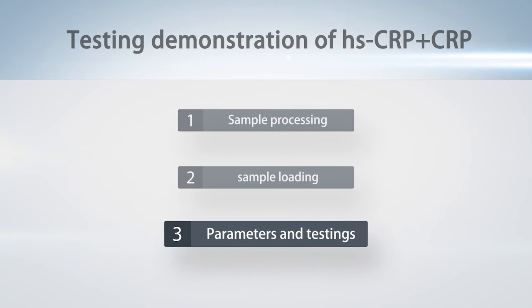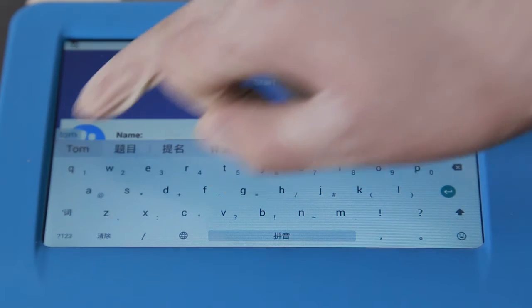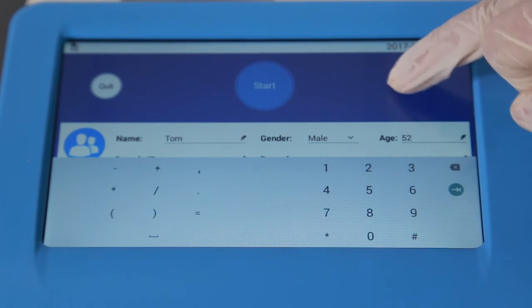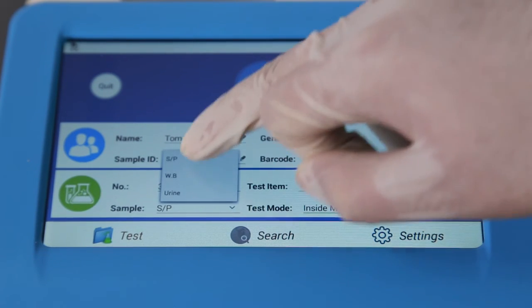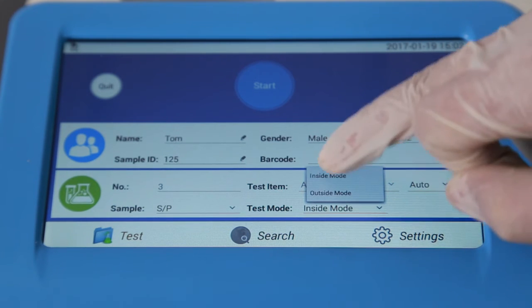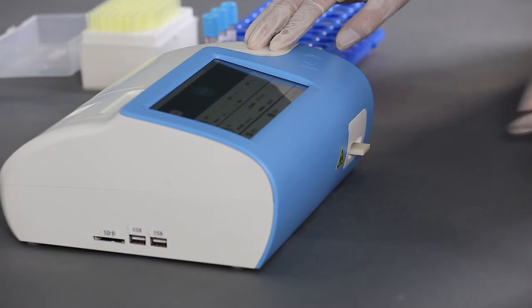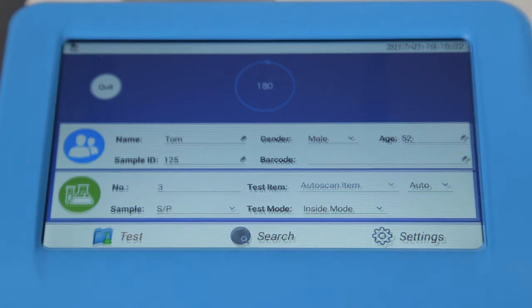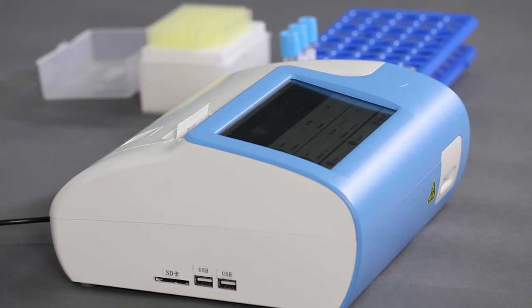Then take out the HSCRP test card and add 100 microliter diluted sample onto it. Step 3 — Parameters and Testing: set up the parameters and input patient information including name, sex, age, and ID. Choose Serum/Plasma and inside mode. Insert the test cassette into the slot and press Start to automatically run the test and print the results.